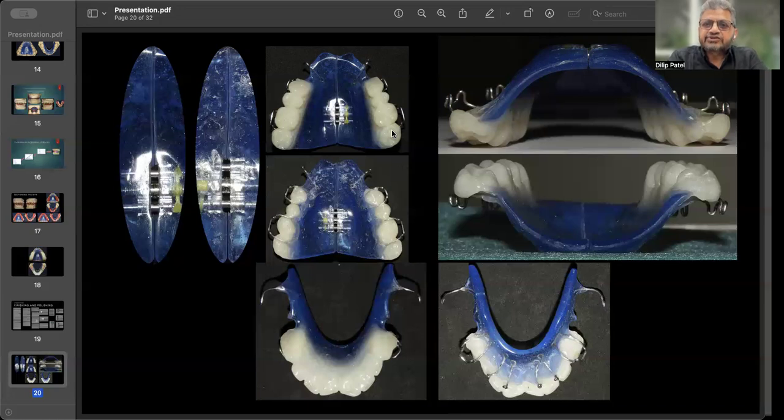Even in the screw area, the thickness of the appliance should not be more than 5 millimeters. For the lower appliance, it is extended up to the last erupted molar. And look at the border, it is very smooth and curved throughout without creating trauma to the mandibular mucosa.